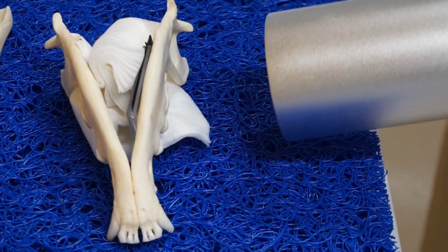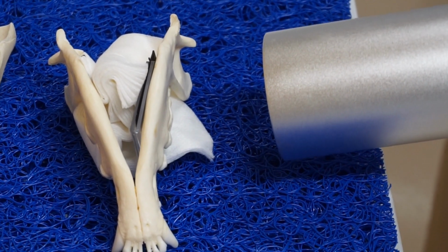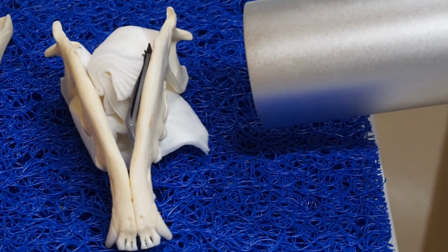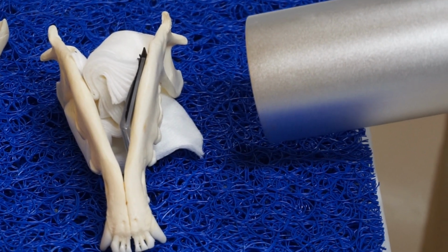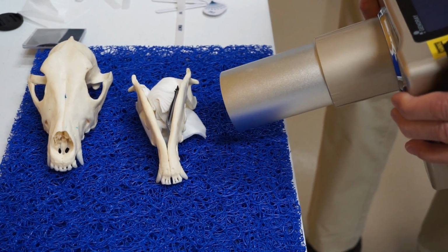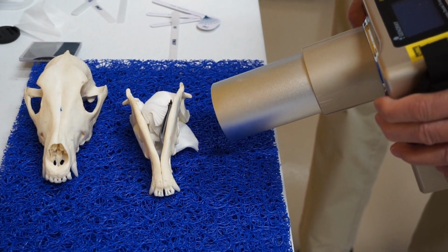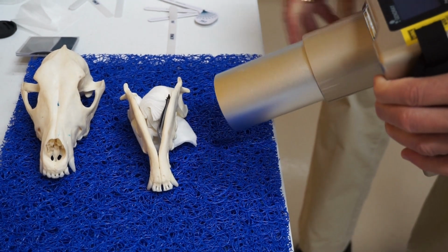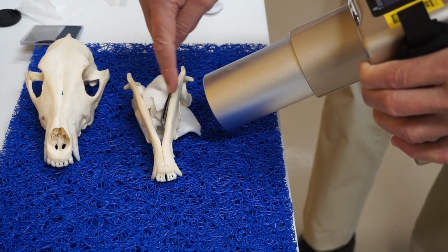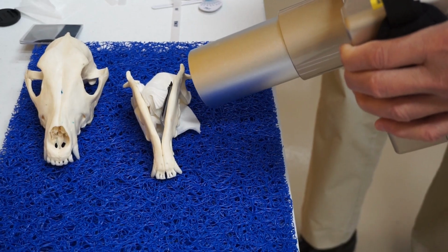So what happens is if you shoot parallel, completely parallel, you'll miss the apices of the roots of the mandibular first molar. So you can still be parallel plus or minus about 15 degrees. So what I do here is you angle up at about 15 degrees and then you take your radiograph. And if you look at that angle, now the X-ray beam is hitting the plate and the tooth is at a higher level, more dorsal along the film.